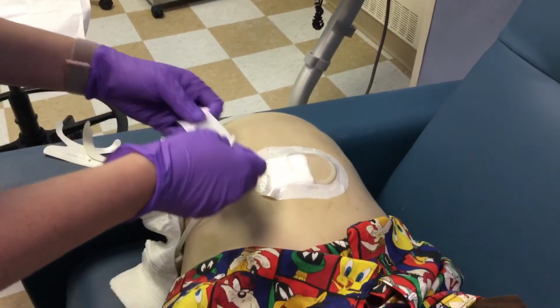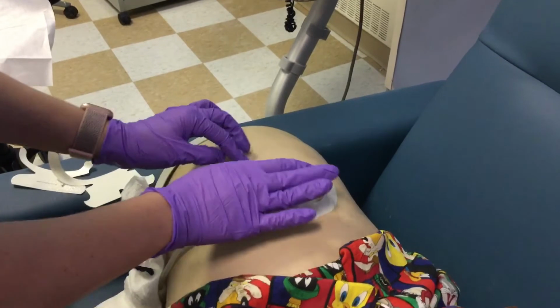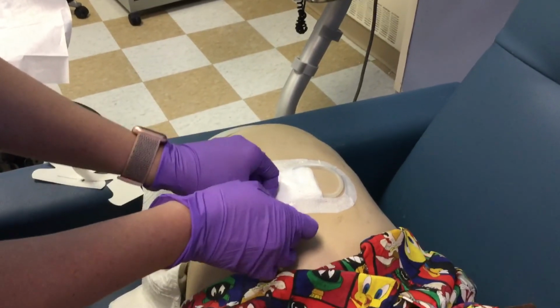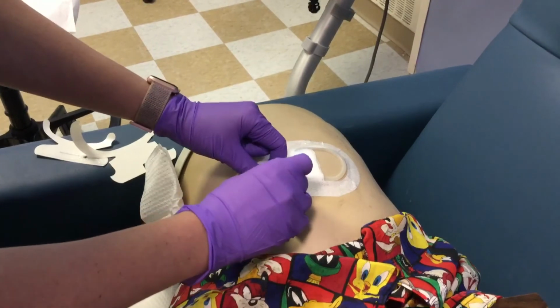You will date, time, and initial the dressing with the pieces provided. Those pieces will also help secure the catheter outside of the dressing. You can use additional Tegaderm or tape if needed as well.